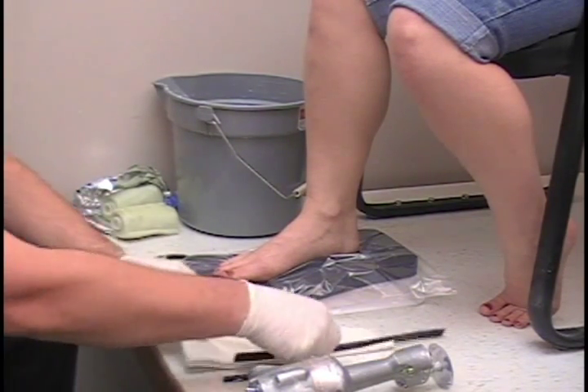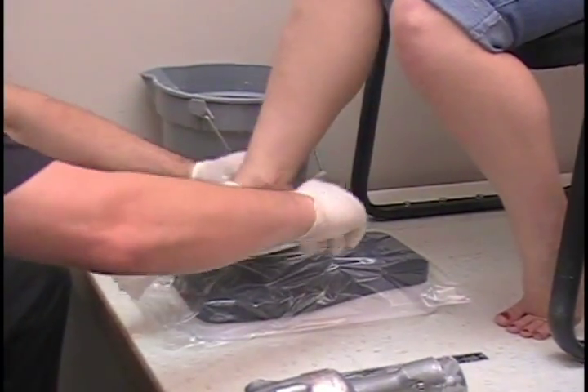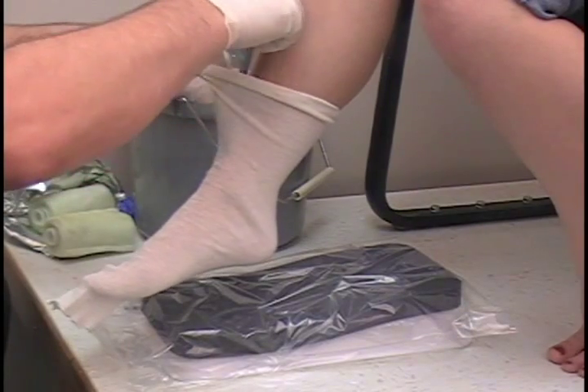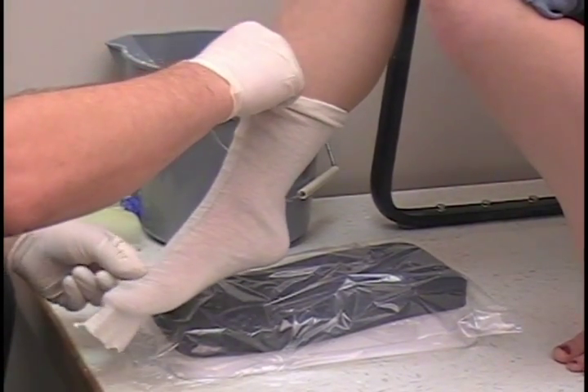All right, so we start by putting the casting sock — the cotton stockinette — on, and we're going to want to put the cutting strip down straight down the shin bone to the toes.